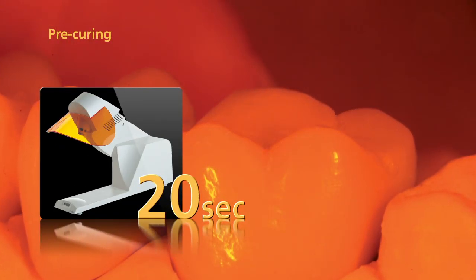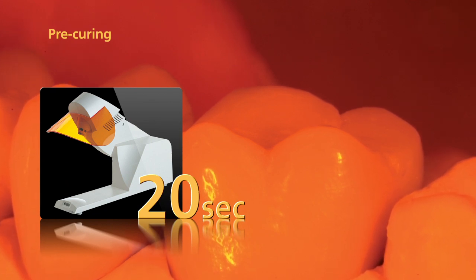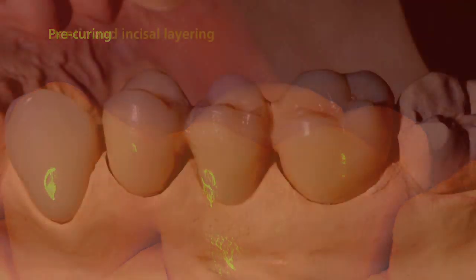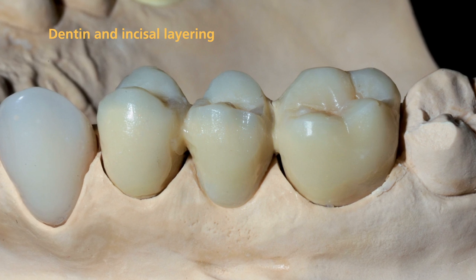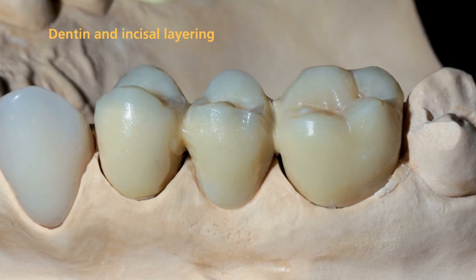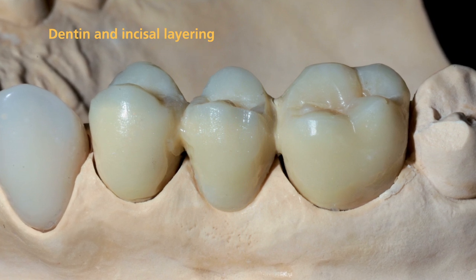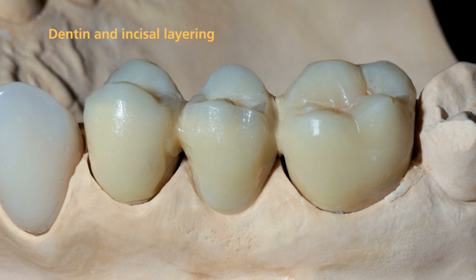As you build up the restoration, consistently pre-cure the NEXCO materials with the quick for 20 seconds each segment. Design the dentin body in such a way that the shape of the Mamelons is outlined in the dentin. In particular, make sure to save enough space for the subsequent application of the incisal and transpa materials.